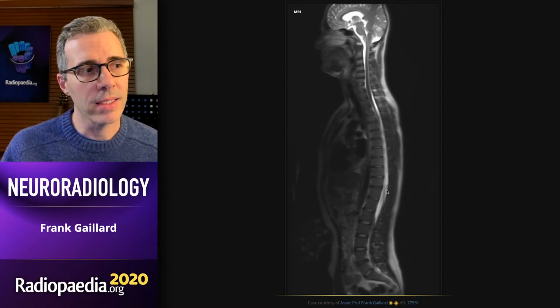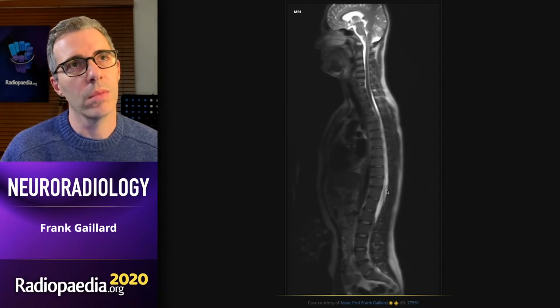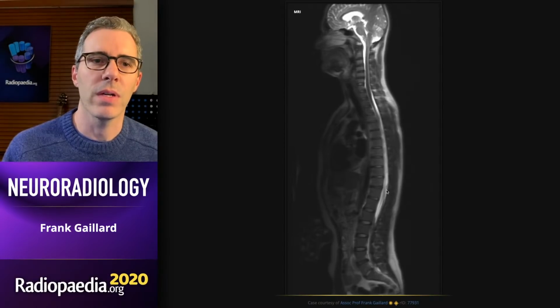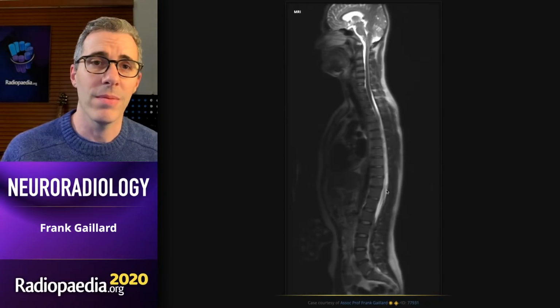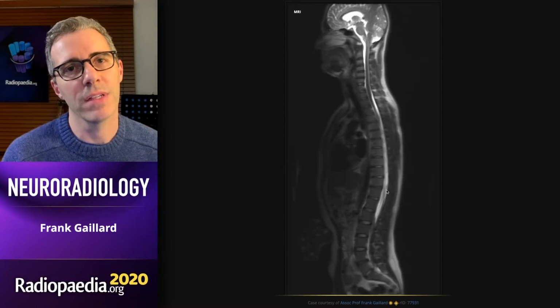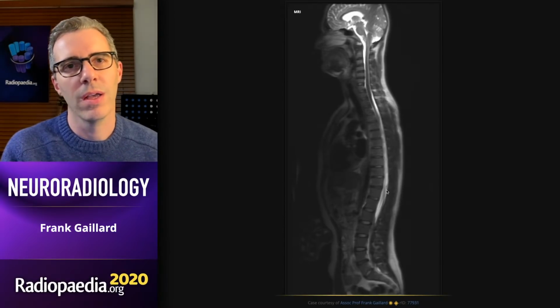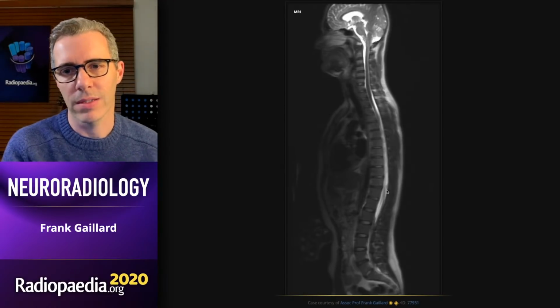And that's particularly the case if there's prior imaging that might have labeled it differently, or there's prior imaging and you don't know how it's been labeled. And there the key is to be precise and transparent so that everyone can understand how you've come to the conclusion that you have. Sometimes pragmatically it's easier to just go with prior numbering, and sometimes you have to say, actually they got it wrong. And this is the correct numbering. This is why I'm calling it this. This is what they've called it before. And in this case, you would want to correct it because it's the symptomatic nerve root that's being compressed.